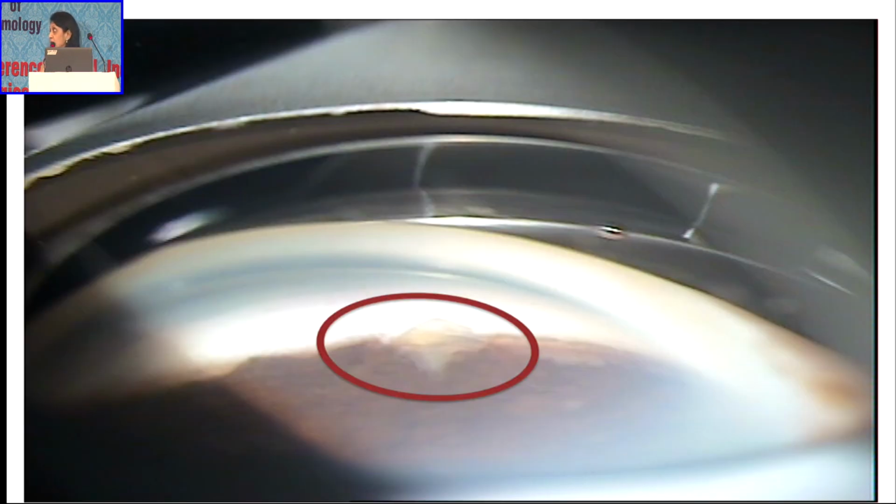Here you're seeing a foreign body in the angle. And that's the inflammatory membrane which you can see curled up in the angle in a patient with acute anterior uveitis. What would this be? That's lens material in the angle. That's a haptic that you can see going through the iris. It's sitting in the angle and you can see the increased pigmentation. The pigmentation is almost 4+.